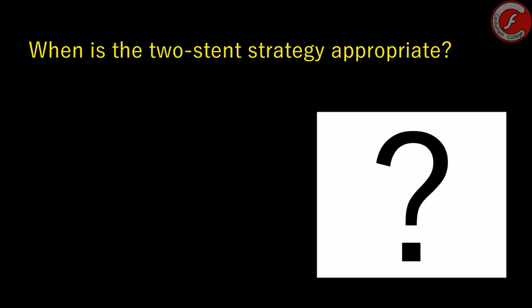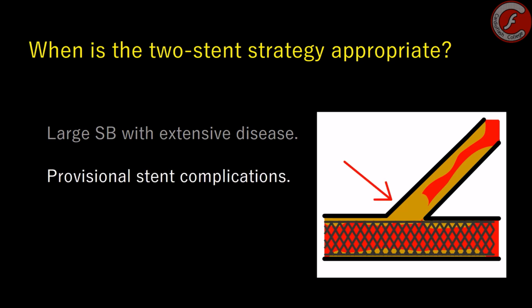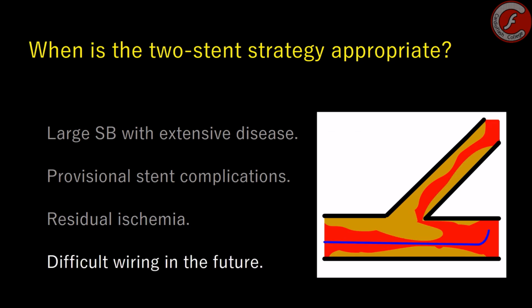Sadly, a provisional stent technique is not always possible, and on a few occasions a strategy with two stents needs to be proposed. In this manner, a two-stent strategy can be considered when a severe and long lesion exists on a side branch with good caliber, when a decreased flow, dissection, or other complication exists on the side branch after a provisional stent technique, when a lesion of the side branch produces symptoms or demonstrable ischemia, and when future access to the side branch is required.